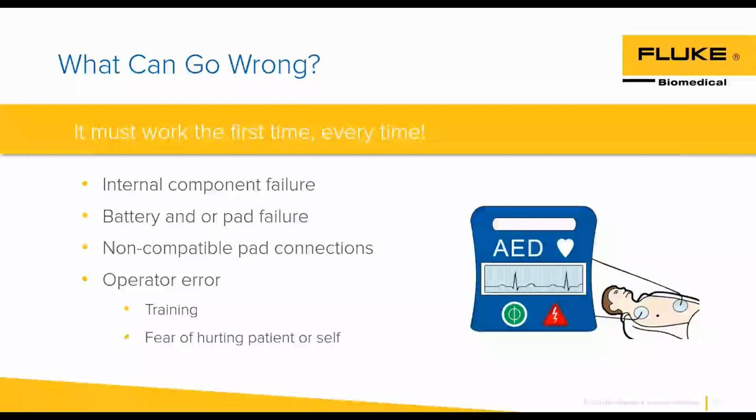Before we move on, let's go back up to the top to the internal component failures. So again, I mentioned I'm a firefighter. I know where my AED is. My AED on my fire truck is in the first compartment on the officer's side. I live in Pennsylvania, where it gets about -20 degrees Fahrenheit in the wintertime. That AED rides around in that front compartment in the middle of winter. It gets to be -20 degrees and it gets cold. And then it goes back into the fire station where it's 50 degrees.